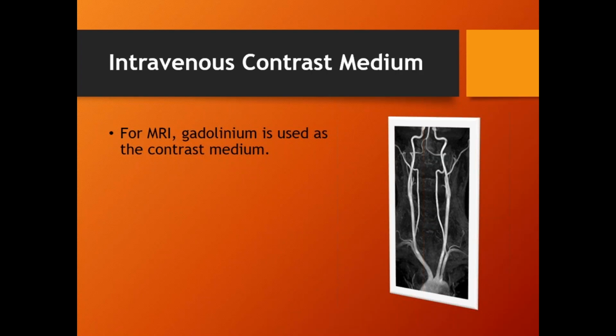All right, hydrogen has 1 electron. Now, if we take this patient and we slide them into this incredibly intense magnetic field, that electron is going to get polarized as it's doing its orbit around the nucleus of that atom. As it's grabbed by the power of that magnetic field, that electron will either get trapped in the North Pole or trapped in the South Pole, depending on where it is when it's grabbed, okay? And literally there's hundreds of trillions of these atoms in your body, all right?